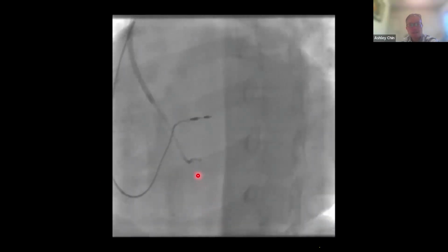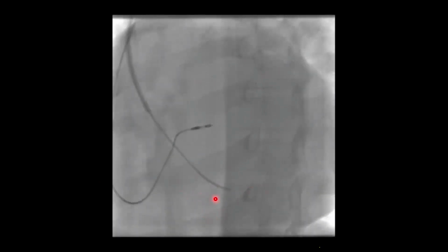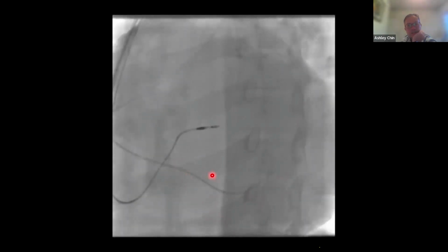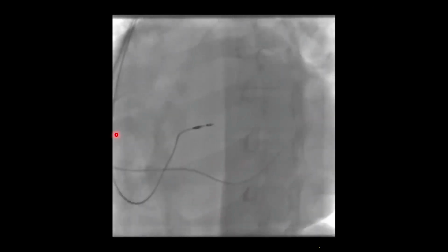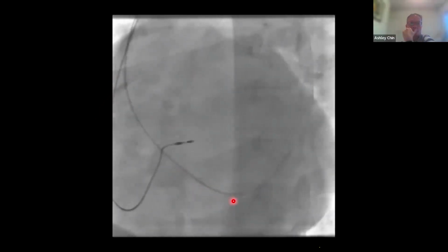Okay, here's the AL1 catheter again. It slipped quite nicely in using a wire. As soon as the wire's in now, you can advance that inner diagnostic catheter forward, and then over that you can advance your sheath. Okay, so this is one option that you can use.